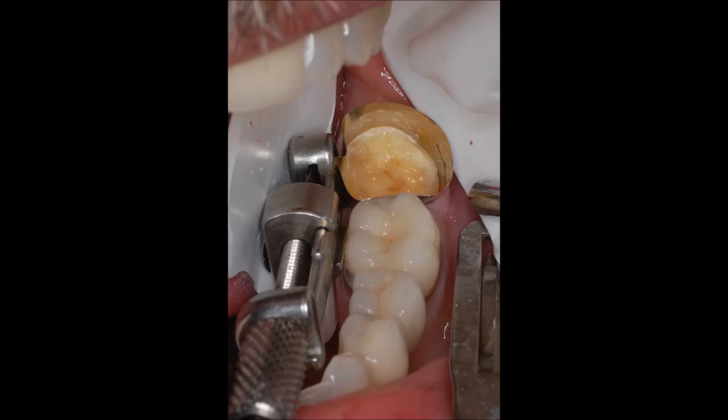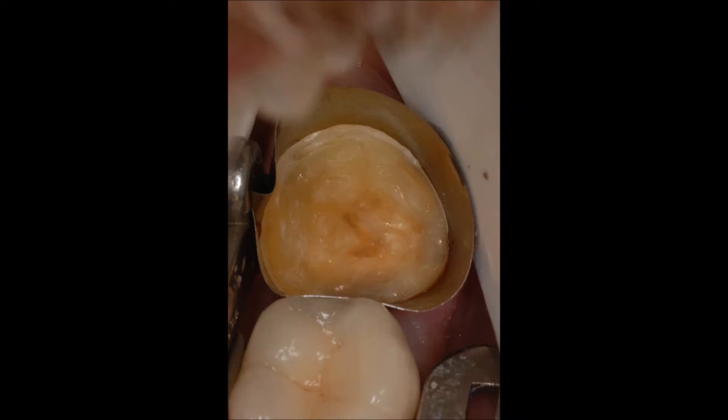Garmers in place. Neo-dry absorptive pads have been placed buccal and lingual. Note how the pads triangulate distal of the prep. Crown buildup is completely isolated — tongue and cheek out of the way, with the saliva ejector busy collecting saliva. Close-up view of the isolation.